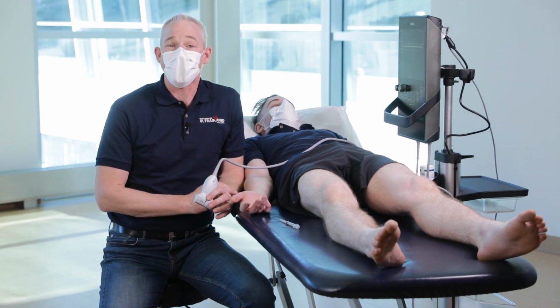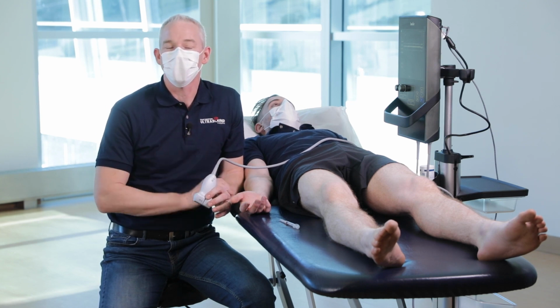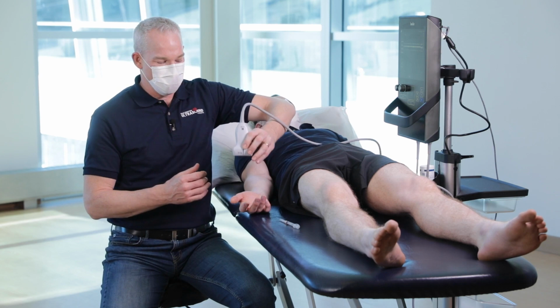I'm going to show you how to scan and inject a trigger finger. A trigger finger is where the tendon gets caught under the A1 pulley. So we need to find the A1 pulley just proximal to the metacarpal phalangeal joint.